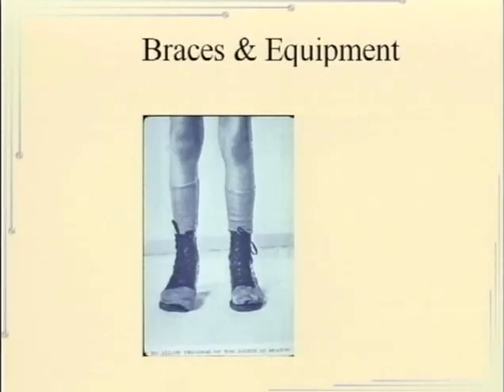The person that founded the Kennedy Krieger Institute was Dr. Phelps, and these braces are from Dr. Phelps's era, and pretty much are made of leather and shoestrings, and just support the ankles. And the principles are the same today as they were back then, that good ankle support is one of the key factors to a gait program, so that you're not collapsing during that initial phase of weight acceptance, because each step starts with putting down your foot and having a good base of support, so that you can then propel yourself forward with the next step.